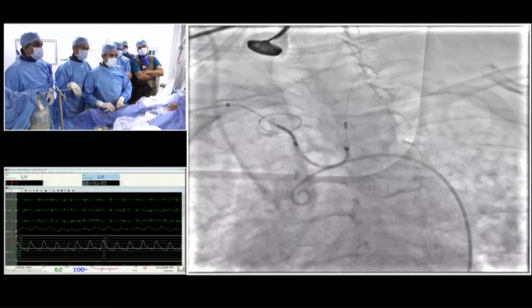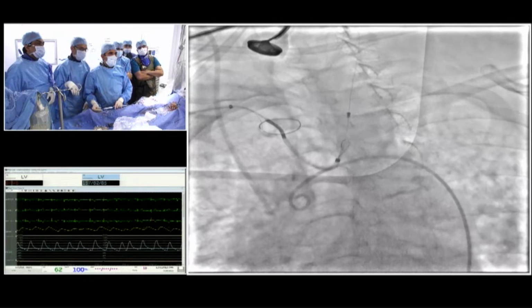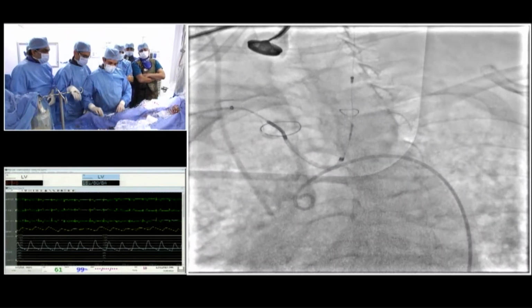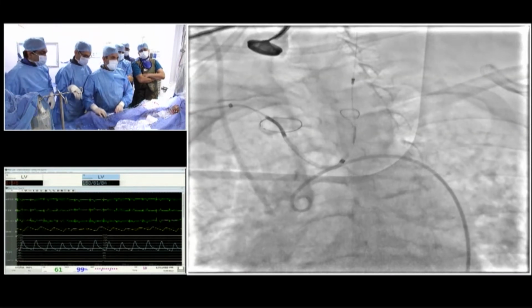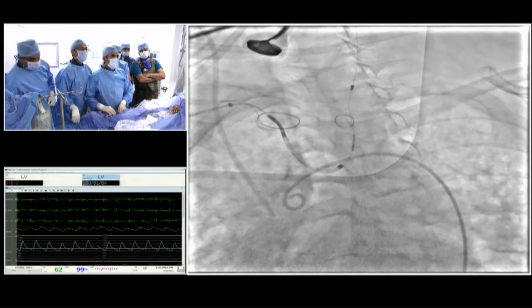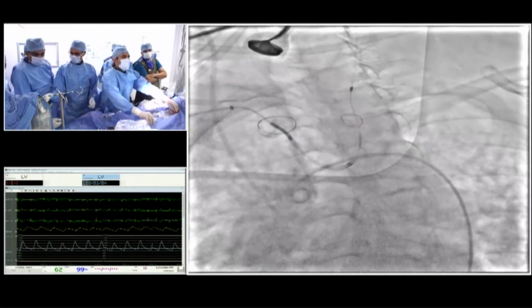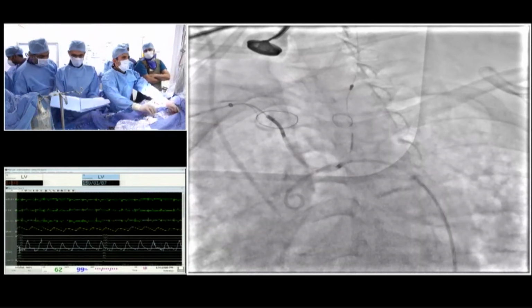It's going to pull back further. Probably do the separate second one a little bit more. Yeah, that's good. Yes, I did that, and now we're going to lock it. Okay. And then just do a small test whether it's going to interact with the pigtail or not.